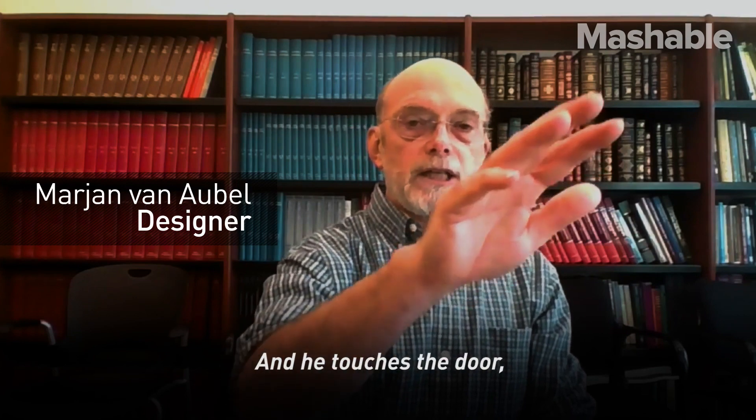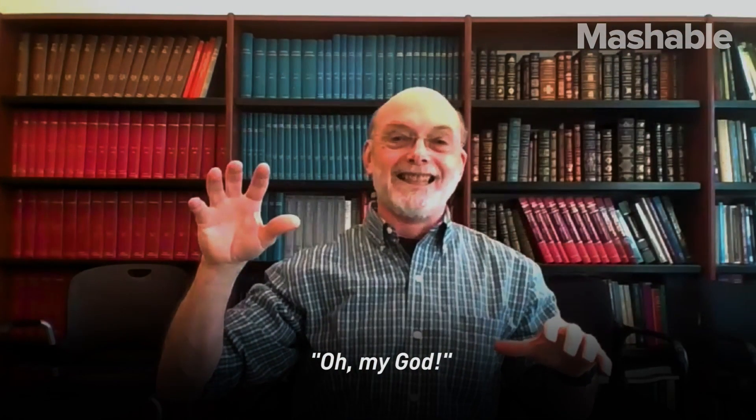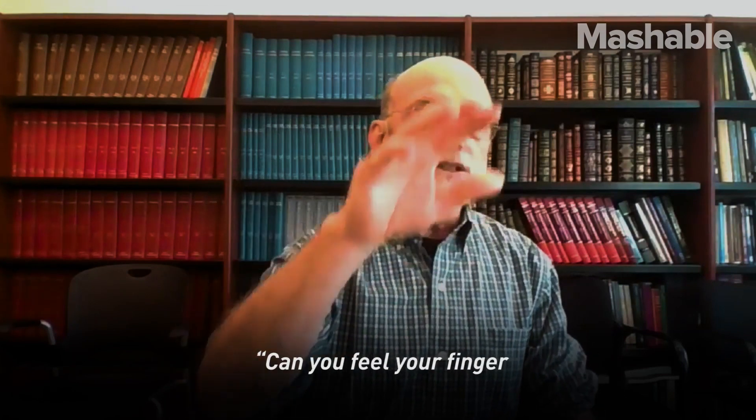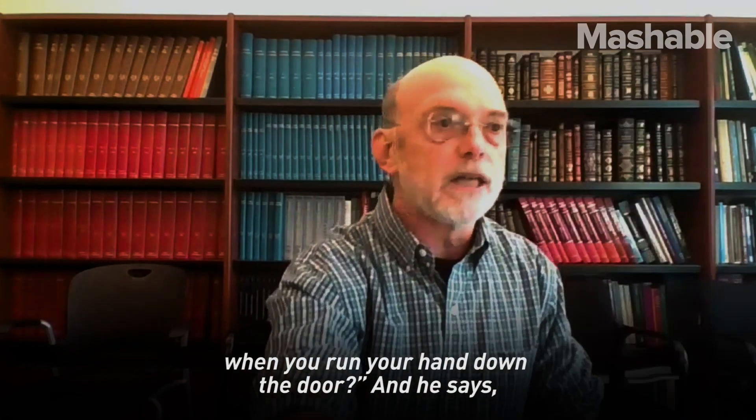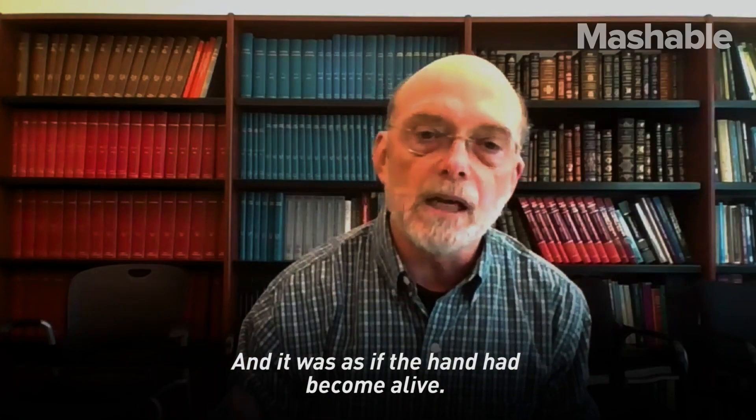And he reaches out, and he touches the door, and he goes, oh, my God. And we ask him, can you feel your finger when you run your hand down the door? And he says, God, that is so cool. And it was as if the hand had become alive.